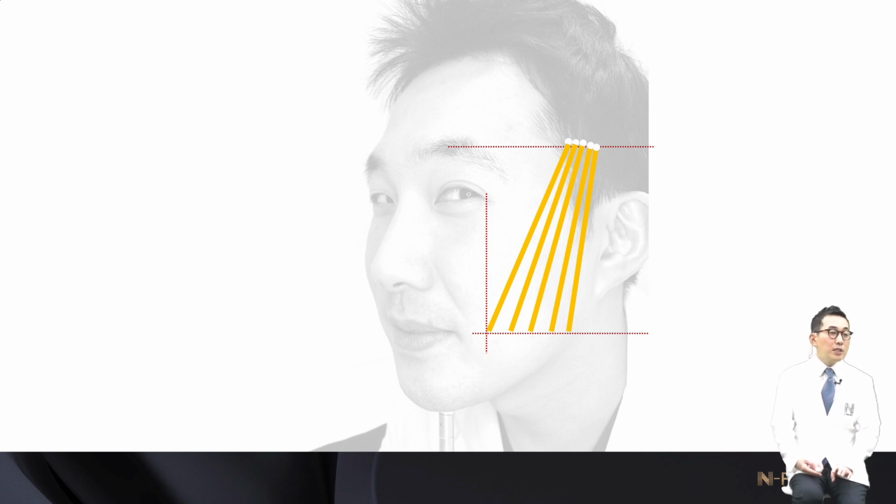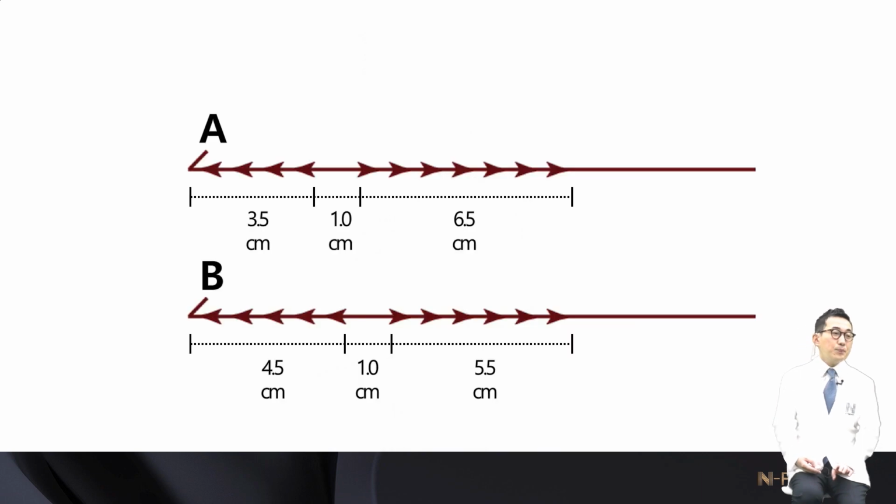This may be the reason why the result is not good, even though your procedure is very well and perfect without mistake as you learned. Both of these threads have 10 centimeter bidirectional cog, but these two threads are completely different for me.